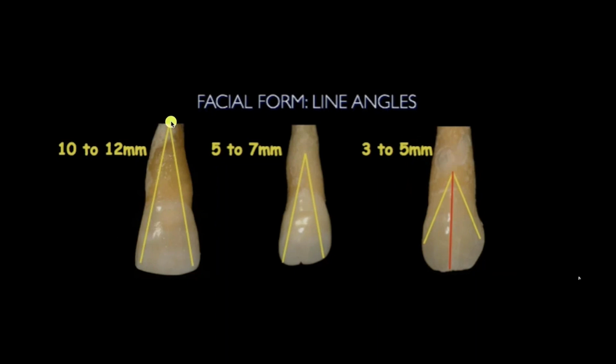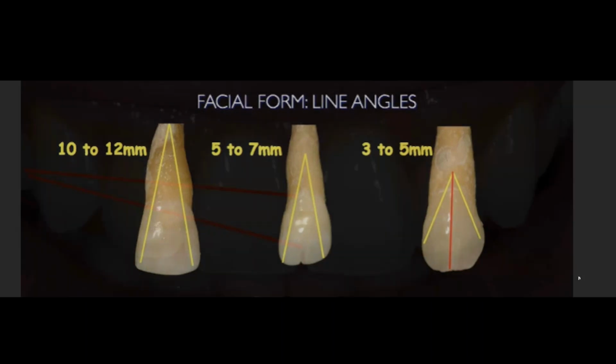And if you draw that dot and then just draw two lines straight up to fill the space, you'll almost always have the approximate line angulation of the tooth. Can you shift them in or out a little bit to widen or narrow the look of the tooth? Of course you can. But from a basics point of view, to have this as a little form to work with as you're working through the teeth is a nice way to do that, okay?